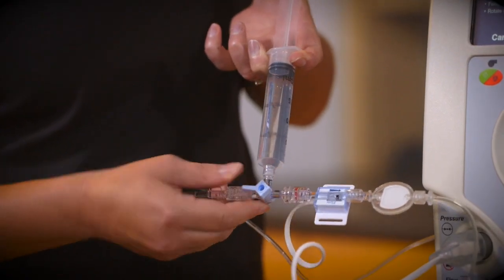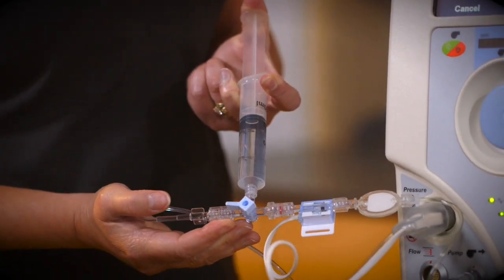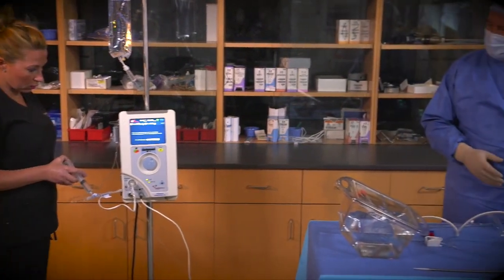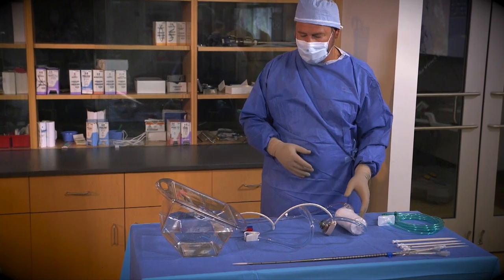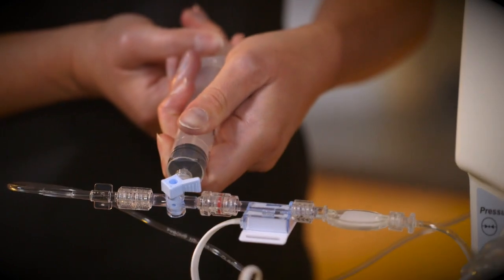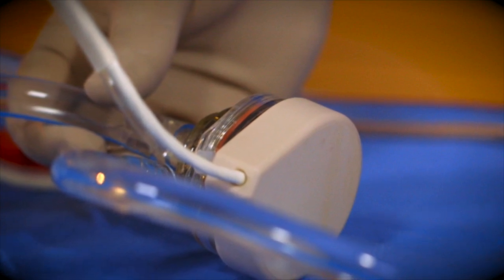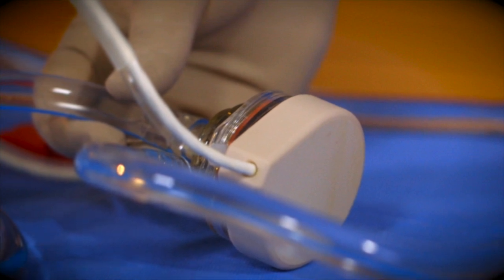The controller operator turns the stopcock off to the infusion bag and open to the pump, then slowly injects 15 cc of heparinized saline into the pump infusion line to prime the lower housing of the pump. This will gradually fill the pump's lower housing. The controller operator refills the syringe with heparinized saline from the infusion bag. The sterile operator holds the pump with the inlet port positioned horizontally — the inlet port is marked with a blue stripe.